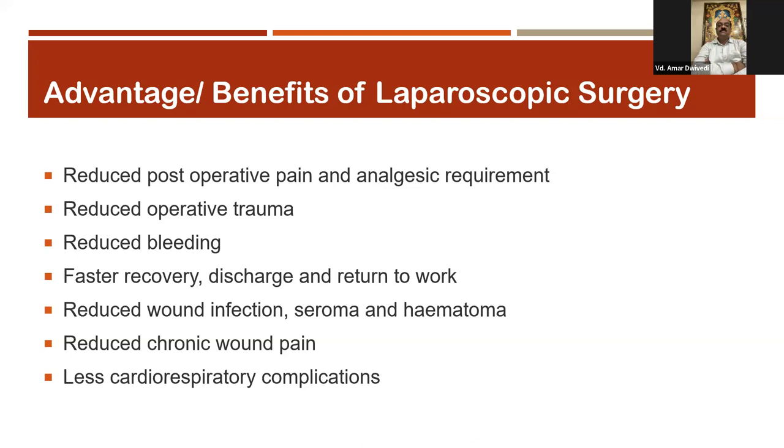It reduces operative trauma also. It reduces bleeding, because due to the very good visibility, ten-fold bigger, we can view the internal organs with the help of the laparoscope. So the visualization is very good, and there is a chance of minimal bleeding in laparoscopic surgery. Recovery is faster, and discharge and return to work are very fast. It also reduces wound infection.